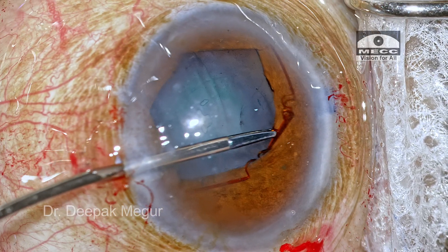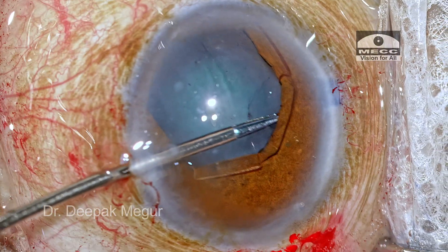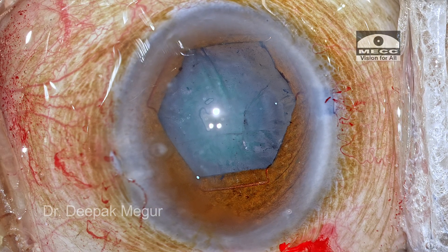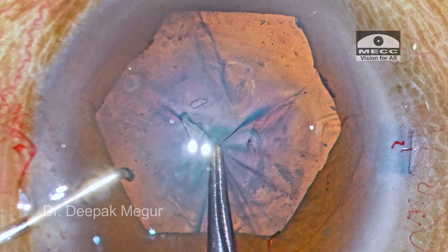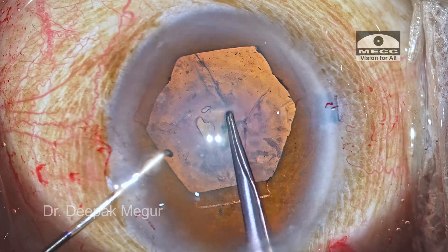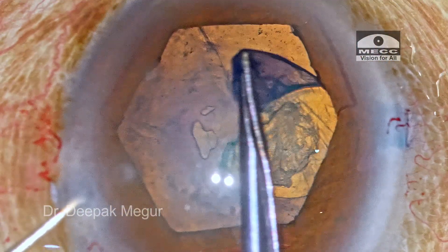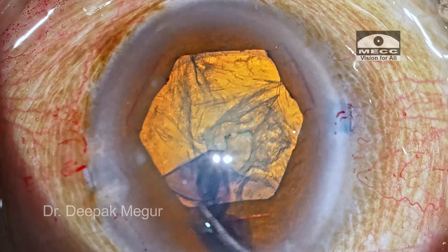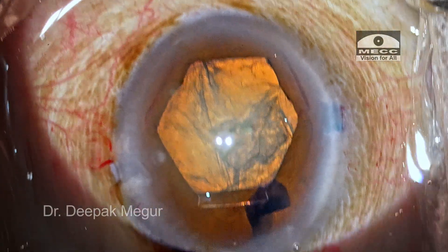This is possible without using any second instrument at all. All six notches are now engaged onto the pupillary margin, giving us a decent opening of about five and a half millimeters. Time to perform the rhexis. The moment I touch the capsule, wrinkling appears from the site of puncture, suggesting zonular weakness. Please note the folds appearing beside the tearing edge — indicative of anterior zonular weakness. The rhexis is around five to five and a half millimeters, which should be sufficient.